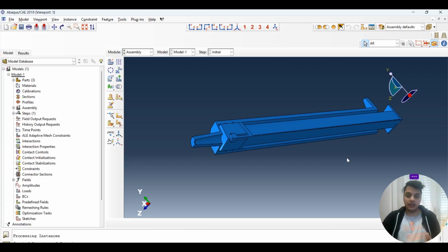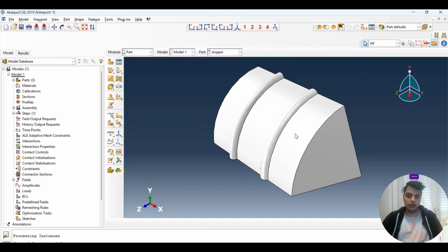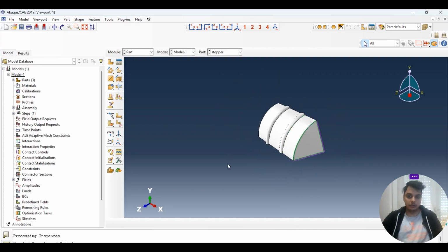So this analysis will tell what the reaction forces needed are, as per the compliances or as per human needs. That's what we will do today itself. We'll try to understand the reaction forces. This is one medical example, but you can apply it to other medical devices also. So as told earlier, if we go to the part, then we have a plunger, then we have a stopper, and everything is designed in SolidWorks.